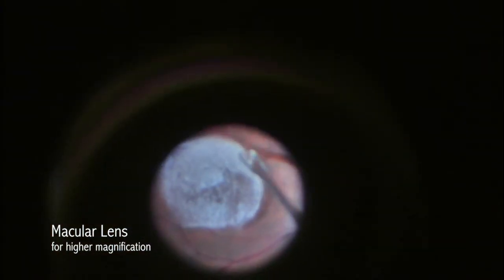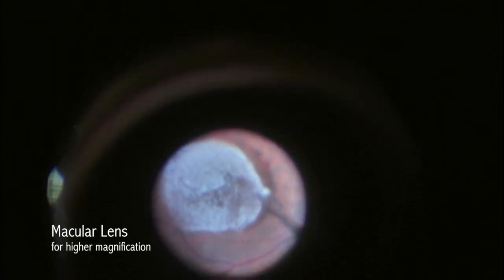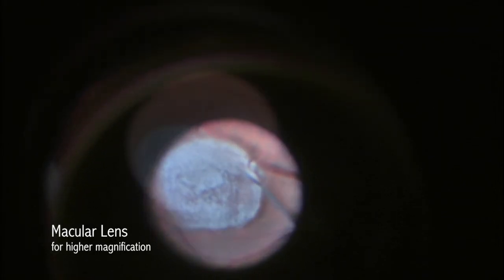At this point, I place a macular lens to get a little better view, and I attempt with ingrasping forceps to try and pinch and peel the posterior hyaloid in order to induce induction of the PVD.